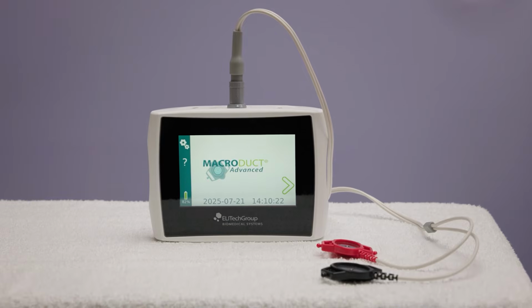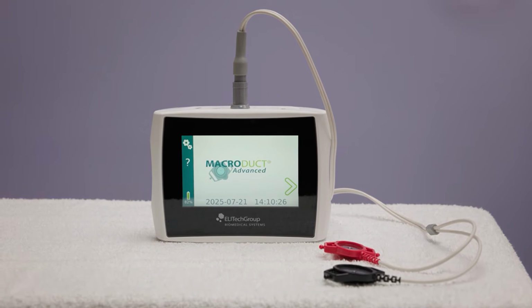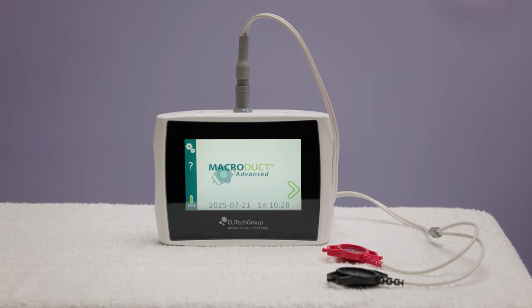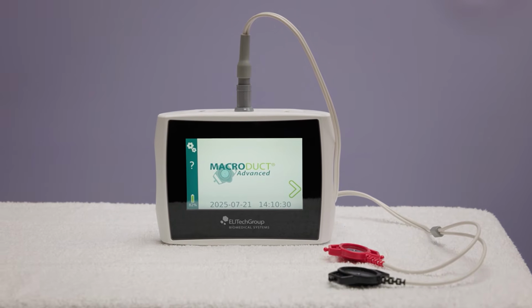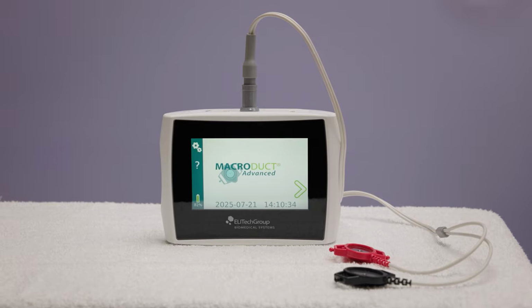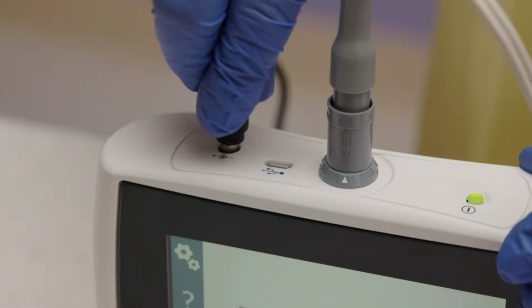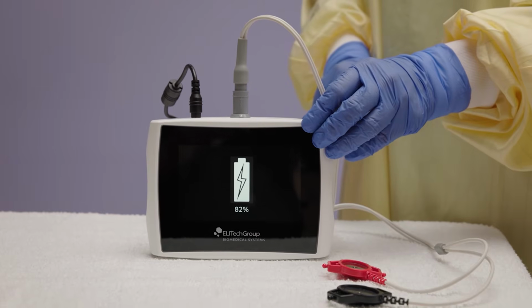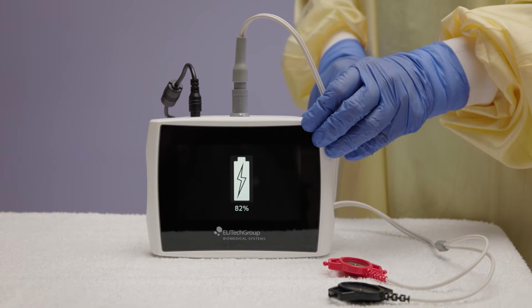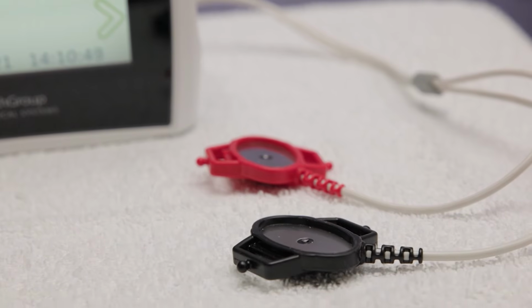In this video, we will demonstrate sweat testing device use. This video shows a Macroduct Advanced Device Model 3710, but the same steps for induction and collection also apply to the earlier model 3700. This system includes an inducer with a touchscreen that will walk you through each step. A battery charging power supply and power cord are included. Be sure to charge and unplug the device before the patient arrives. The electrode cable assembly includes a red and black electrode.